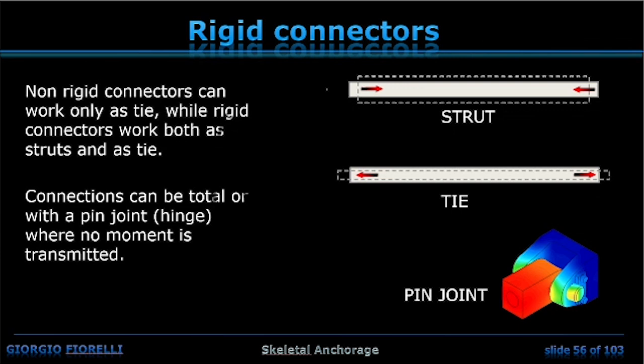The tie works effectively only when we have an elongation of it. That is, it transmits a tension force between the 2 points of ligature, to the reactive unit and to the TAD. Otherwise, if the force is not applied to elongate the tie, the tie works in a way as a hinge system. That is, the tie stays elongated and rotates around the 2 points of ligature.